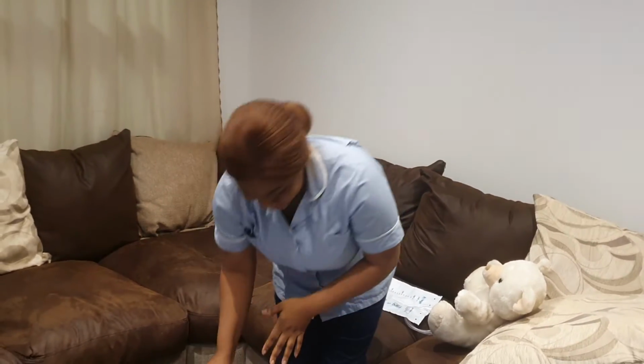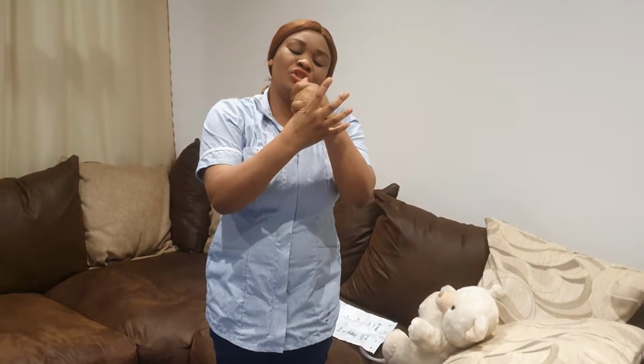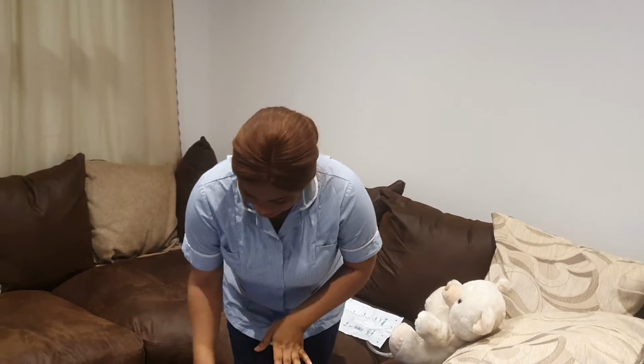All right, guys. So then I'll do my hand hygiene, and I'll validate my equipment. Palm to palm, right palm over left dorsum, vice versa. Fingers interlaced, fingers interlocked, rotation of the thumb, tips to the finger, and the wrist. So guys, my hands are clean and I need all the equipment I require now.